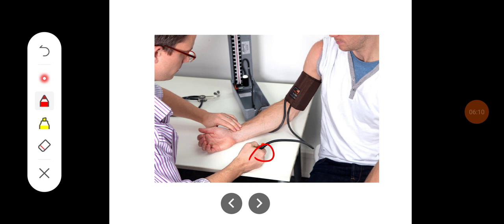Then you increase the arm cuff pressure by another 20 to 30 mm Hg. Then start unscrewing the air pump, and at a point the pulse reappears, and that point is the systolic blood pressure.